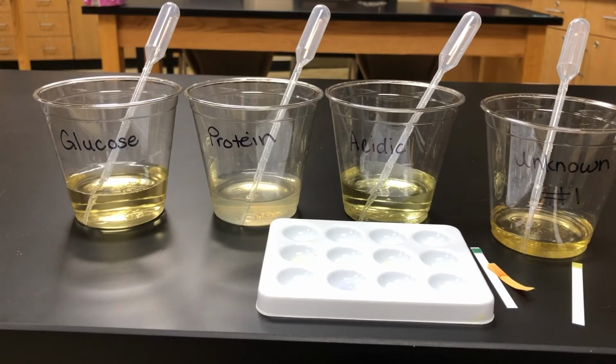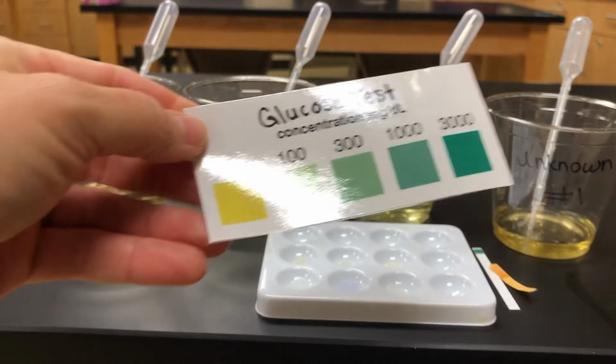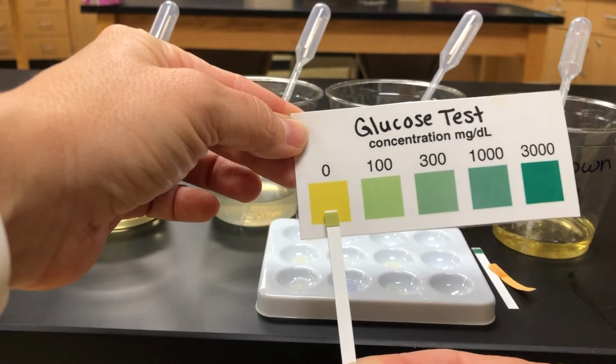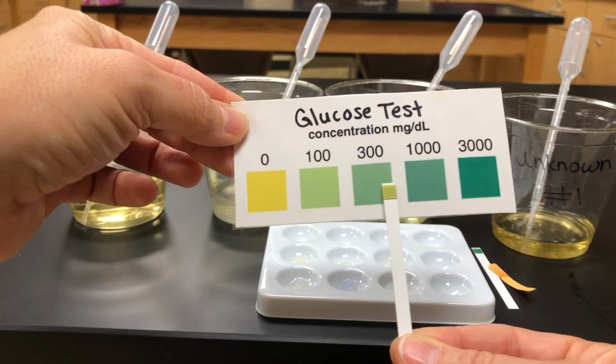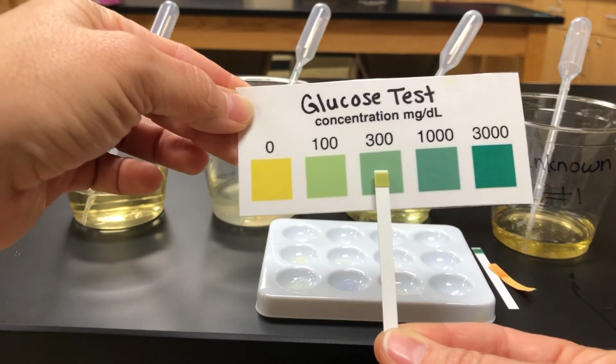Okay, let's take a look at our glucose strip. And again, this is part B. We're all done with part A. So this is our glucose strip for part B. Okay, we've let it sit for a couple of minutes. And you want to write down your results for part B.